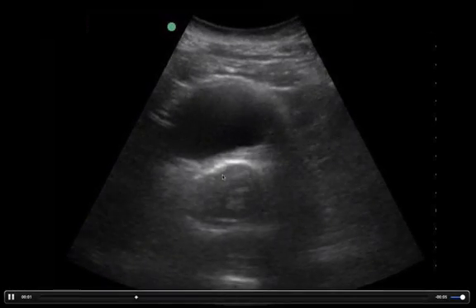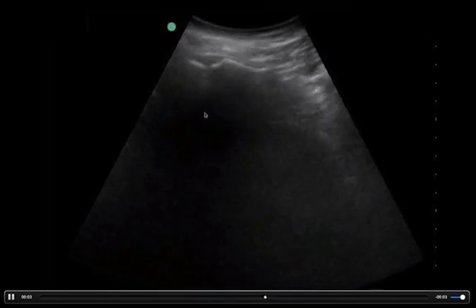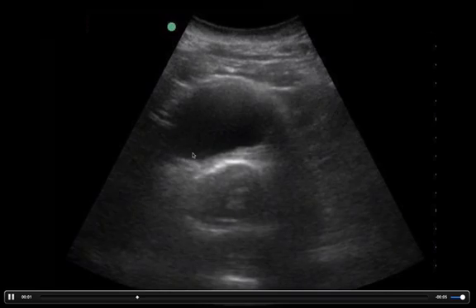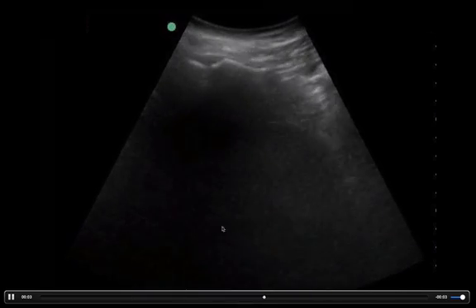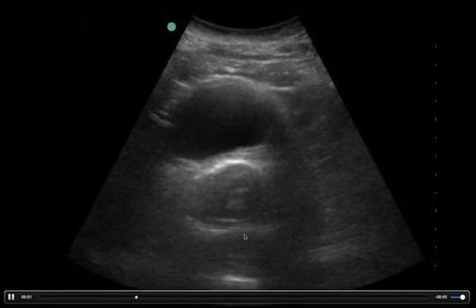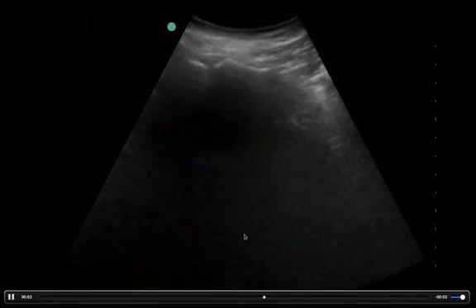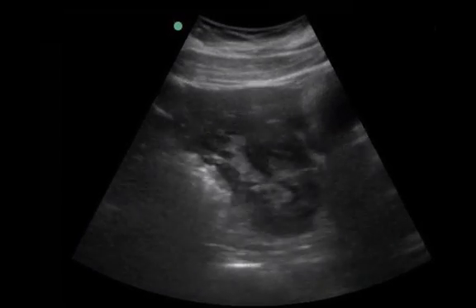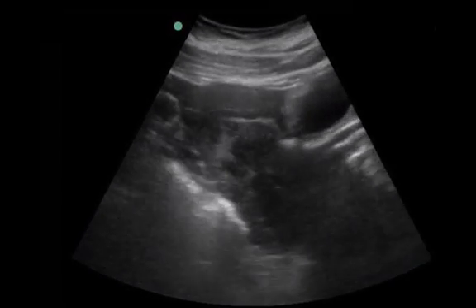We then moved down to the bladder and uterus, and that actually looked negative as well. This is our transverse, or short axis, view. We have the bladder here and the uterus here. We'd normally be looking for fluid between the bladder and the uterus or in the posterior cul-de-sac — and agreed, there's nothing obvious. So did you stop there and call it a negative FAST? Nope — we turned the probe into the longitudinal view of the bladder.